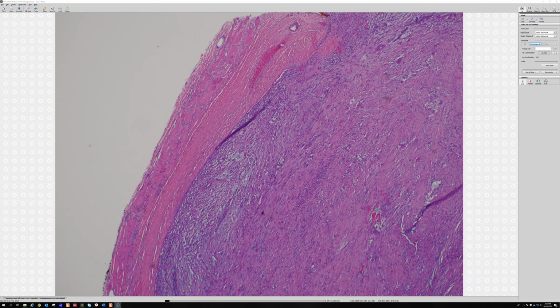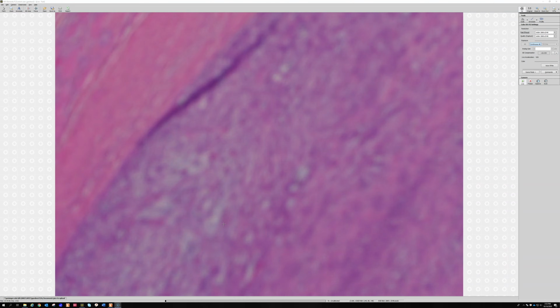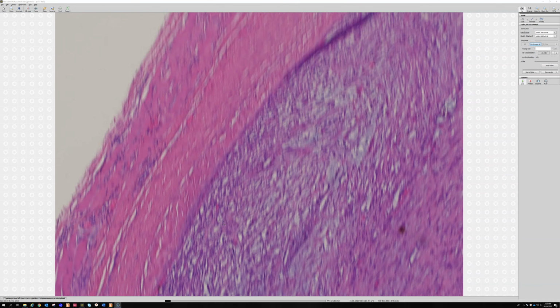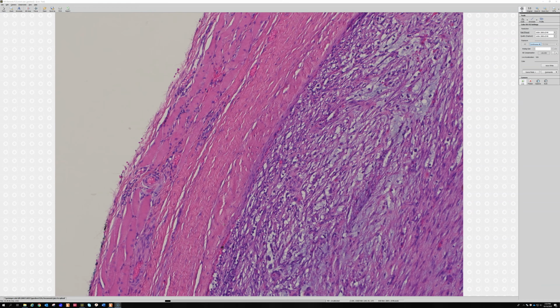And then usually nodular fasciitis arises from the fascia, right? So thus the name. And we call it fasciitis, and the itis name makes people think it should have a lot of inflammation. I feel like it usually does not. You might find some scattered lymphocytes and histiocytes in there, but it is not usually a highly inflammatory or inflamed lesion, despite the itis name. So I think that's important, that a lot of people expect there to be inflammation, but usually there's not much inflammation.